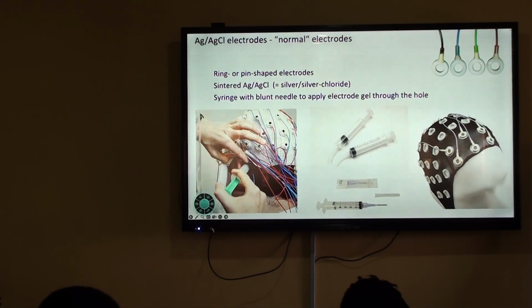The European style of hair is very straight, so even for participants that have long hair or a lot of hair, it's relatively easy to fit it under the cap. But if you have curly hair, you just need a bigger cap. So I've brought six different EEG caps.